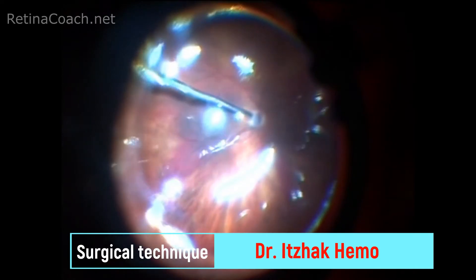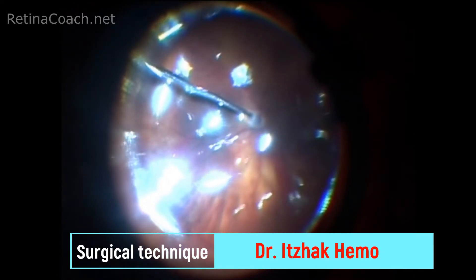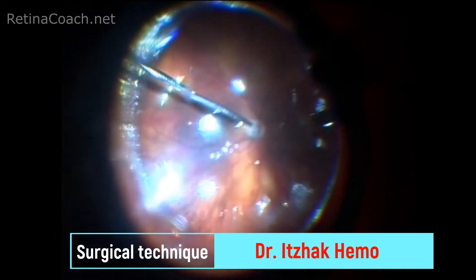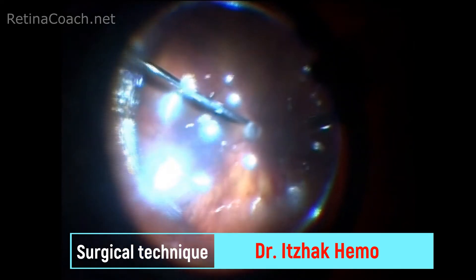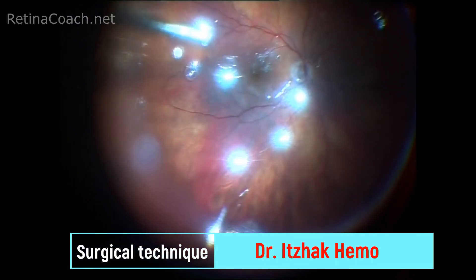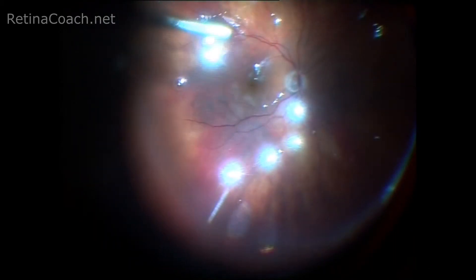In conclusion, a few things should be remembered while aspirating the PFC at the end of the case. First, use the soft tip cannula to remove the liquid, because a blunt tip cannula could cause damage to the retinal or optic nerve head surface.